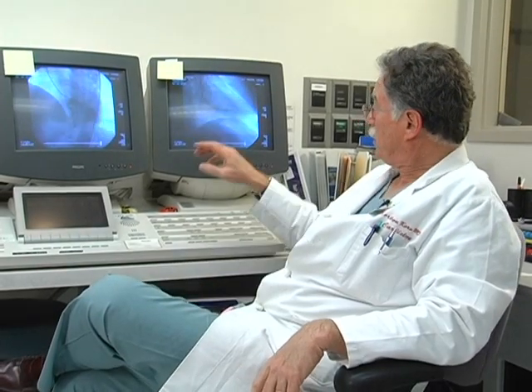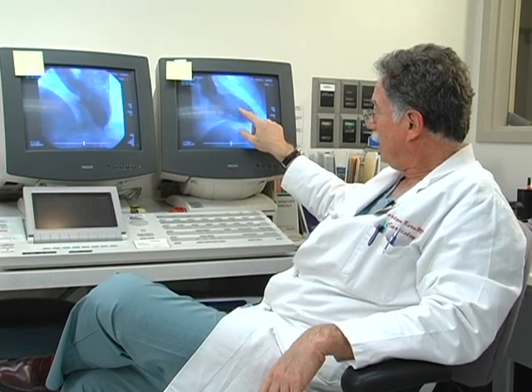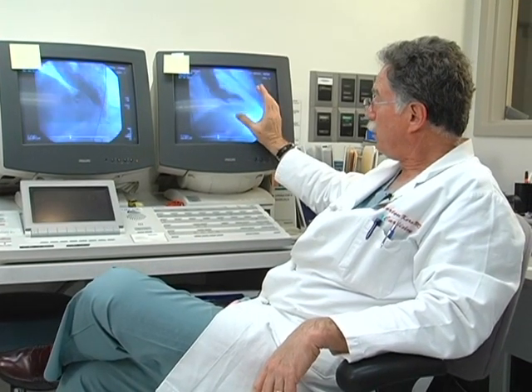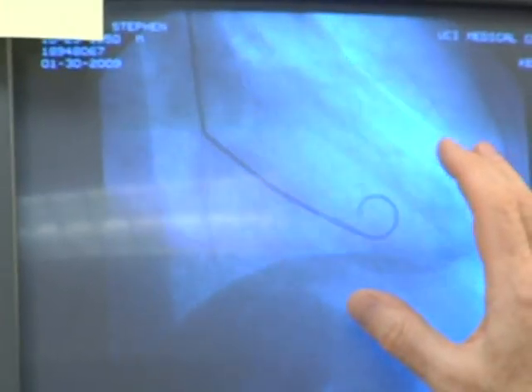So at the conclusion of coronary angiography, we performed ventriculography. And as you can see, we inserted the pigtail catheter into the ventricular cavity and measured pressure, which we'll talk about in the next segment. And after we measured our pressure, we injected X-ray contrast under high pressure with our automatic injector system.